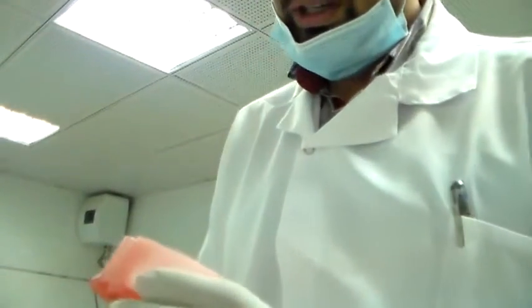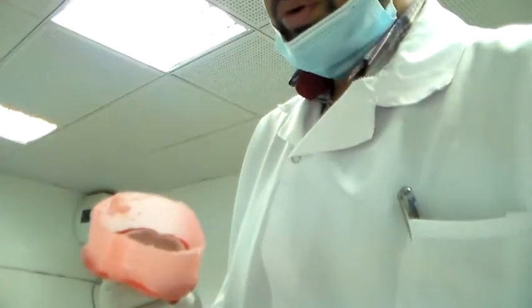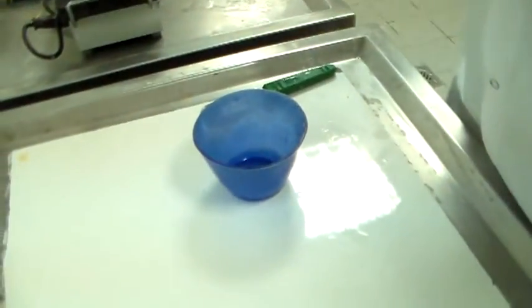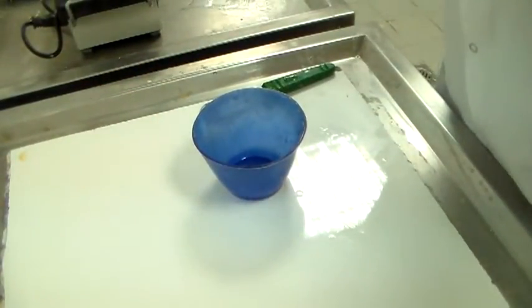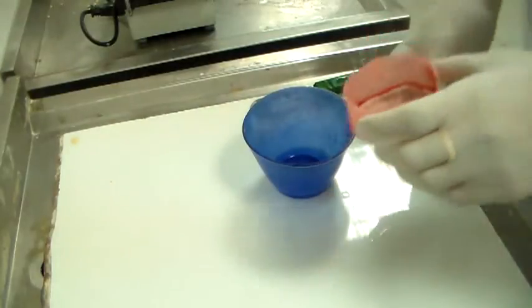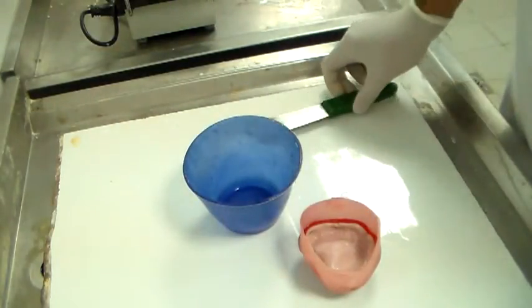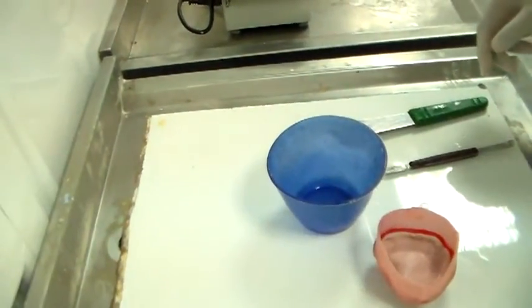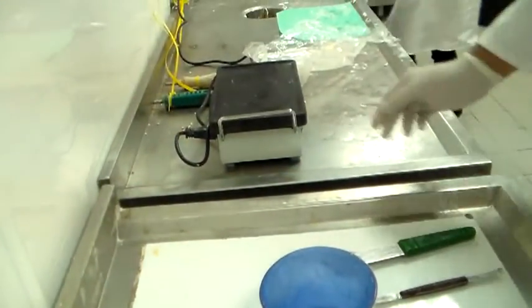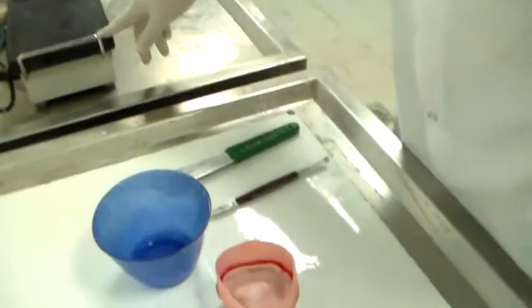They've come to the lab with the impression that it's beaded and boxed and we're going to pour it. I have my equipment here — my armamentarium. I have a rubber bowl, a spatula, a wax knife, and of course a vibrating unit, which is useful for removing the air bubbles from the stone.